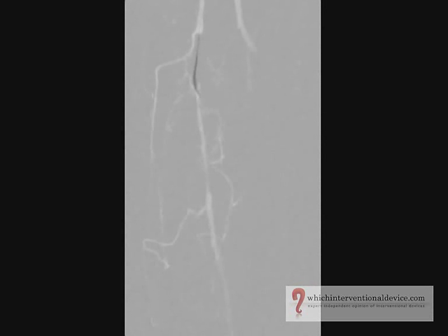Here a guide wire has been pushed forward in a loop using a COBRA catheter and pushed through the occlusion in the sub-intimal plane.